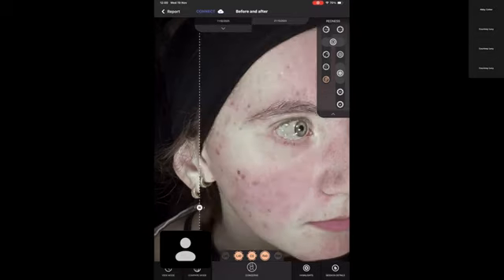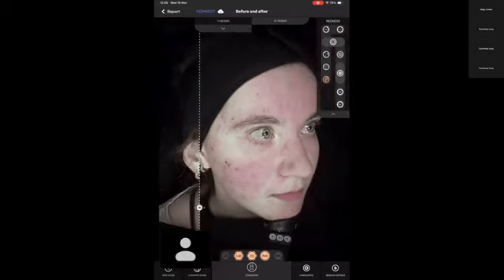So this is a really, really nice way, and again, to include the patient in the consultation, to include the patient in the follow-up. And, you know, the iPad is an essential part of that process. You really need to take the iPad off the IQ and sit with the patient and show them their own skin. And this will be a game changer for the consultation process.